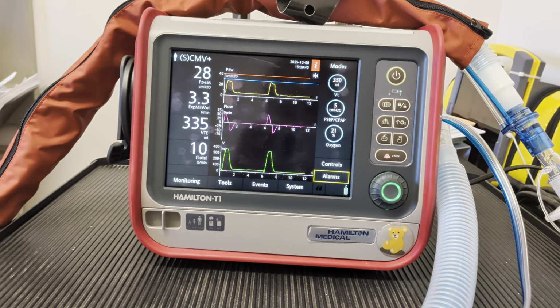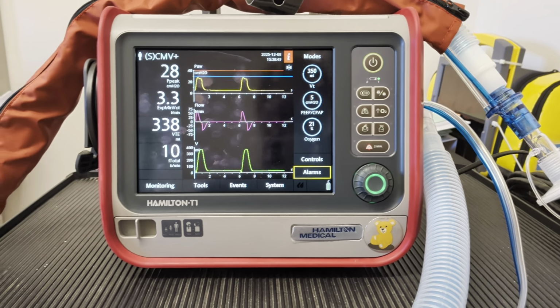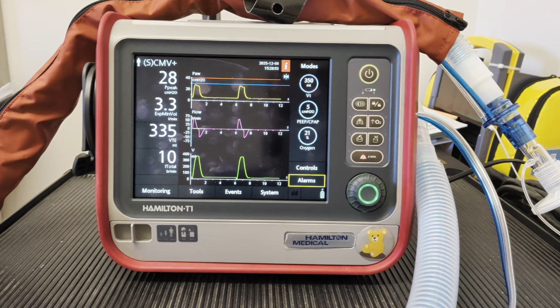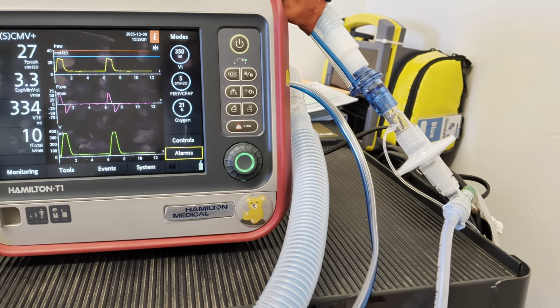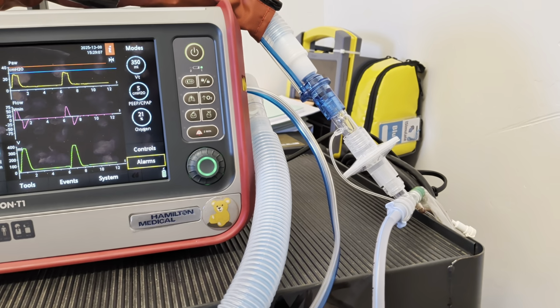So that is to say that the artificial airway has been displaced, pushed in too far, or pulled out of position, or something has been displaced when it comes to the ventilator circuit, right? That's D. The O is obstruction. Is there some sort of obstruction? One of the common things you're going to run into is kinking of the circuit and/or tubing, right?